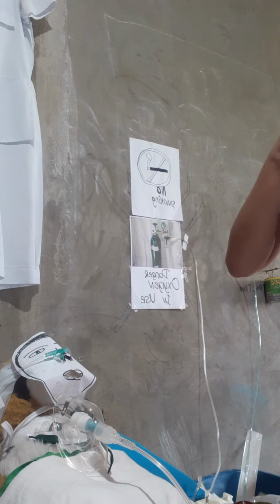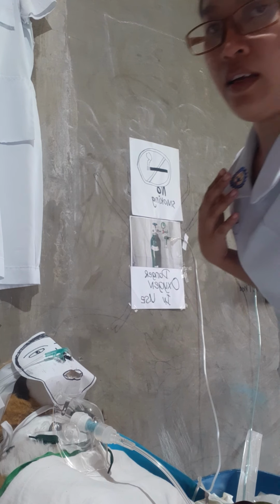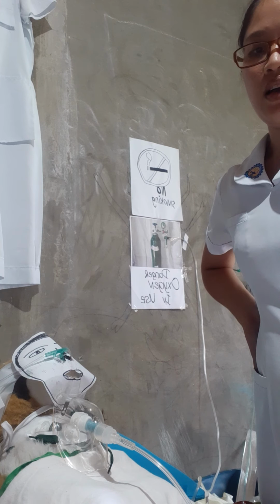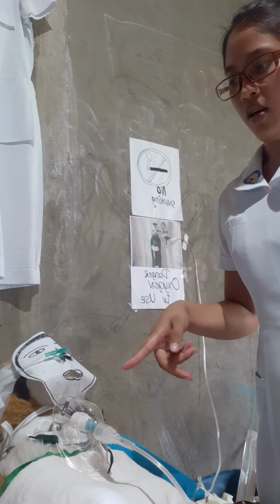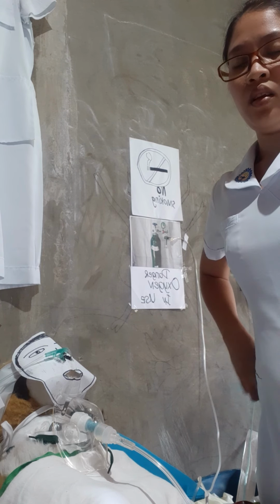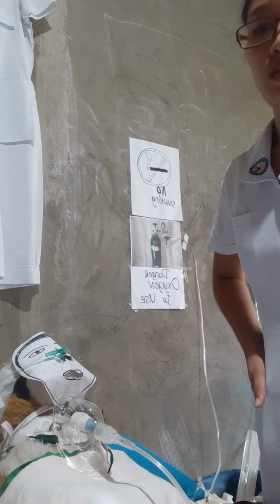And then the type and size of the tracheostomy tube, the frequency, the extent of the care type, the color, and the amount of secretions that we remove from the suction or the tracheostomy site. Also, the patient's tolerance towards the procedure, and then special care in the event of an unexpected outcome.